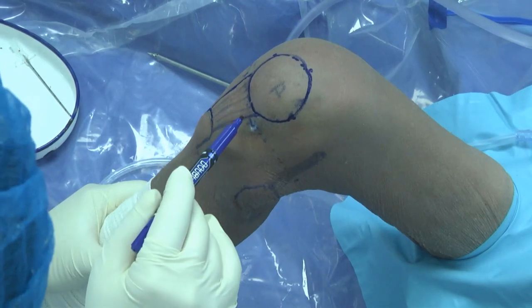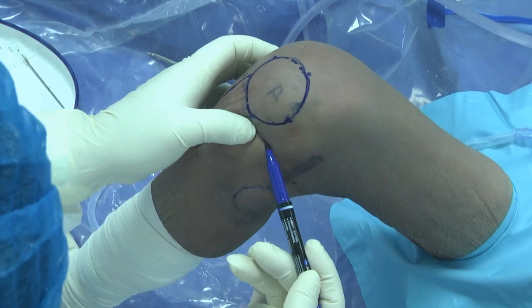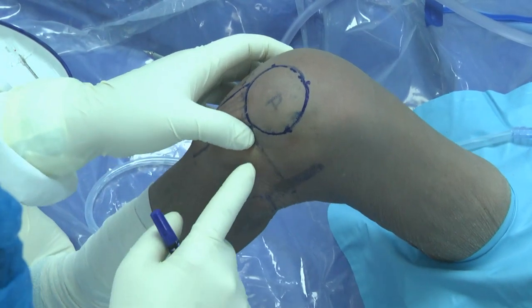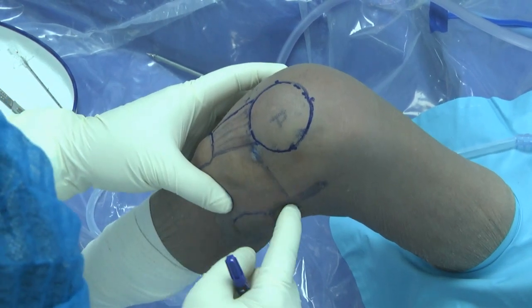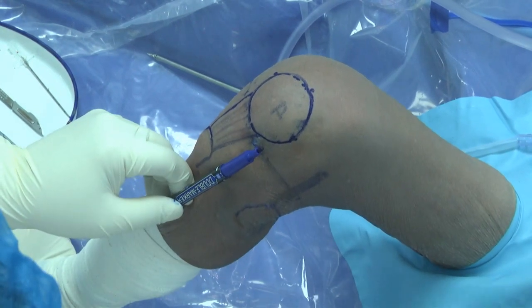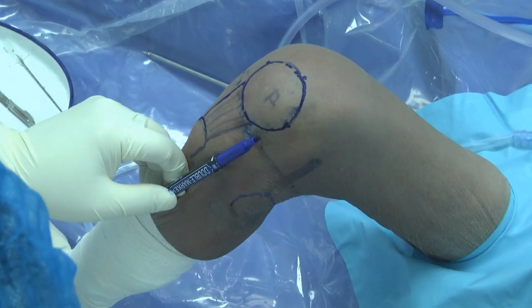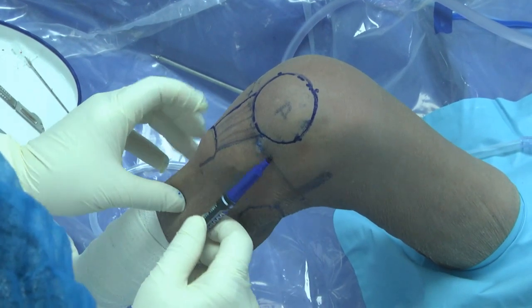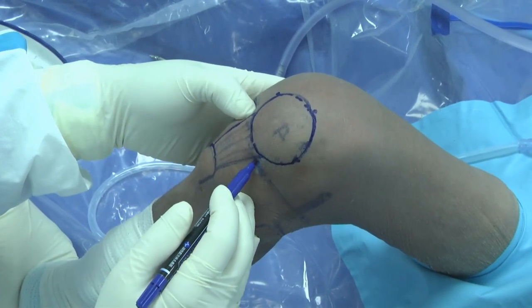Okay, the first landmark is the lower pole of the patella. 那先要找到髌骨下棘。You draw the line. This line will be on the soft spot. 然后在屈膝九十度下面呢，沿着髌骨下棘画一条横线，中间就会遇到一个软点。We are lucky, in these patients we can feel the joint line very well. So this is joint line. 软点还有这条线就是关节线，非常好找。So as we know, we have some posterior slope. 而且胫骨是有后倾。Maybe it varies from 5-10 degrees. This is a normal tibial slope. 自然的后倾角是5-10 degrees.